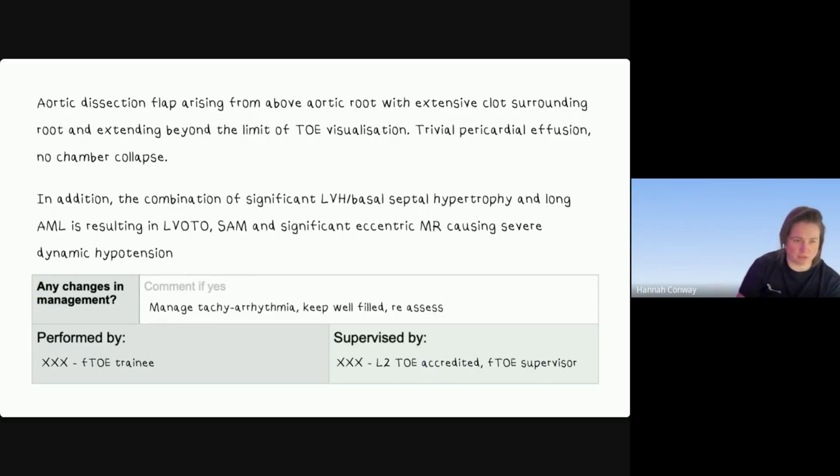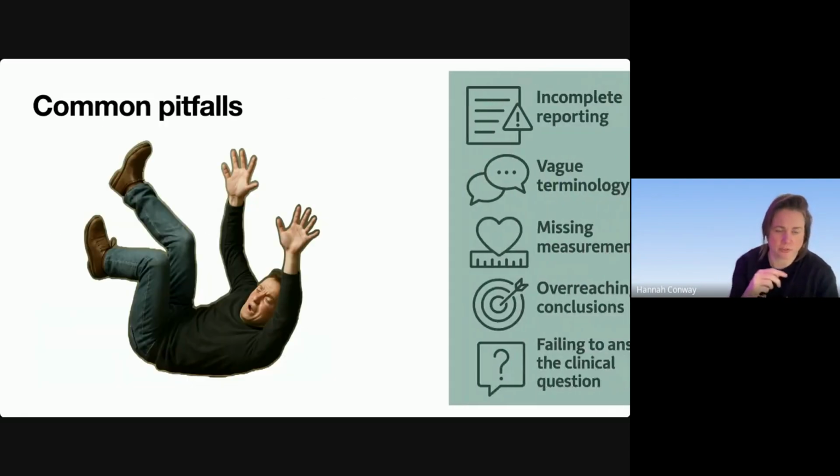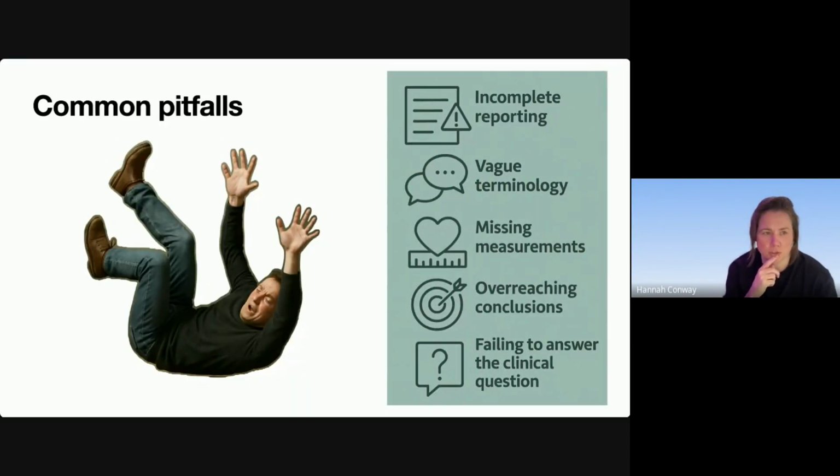And obviously we know how to manage SAM. It's slightly different in this patient because we don't want to push their SVR up, but just give a little bit of a sort of general idea about what you think's right to do with this patient. So just to finish off, common pitfalls with echo or focused TOE, and I'm tailoring this to what we've seen in the exam. So incomplete reporting.